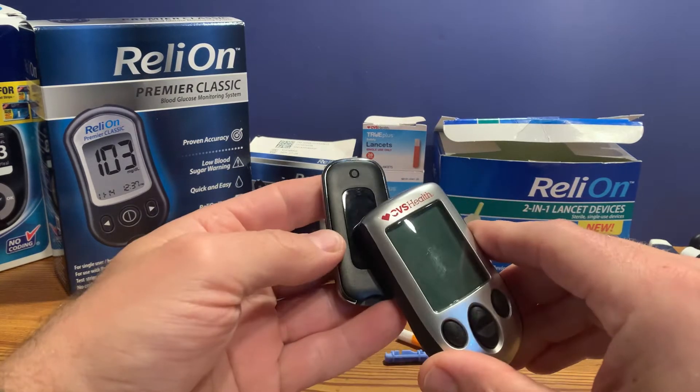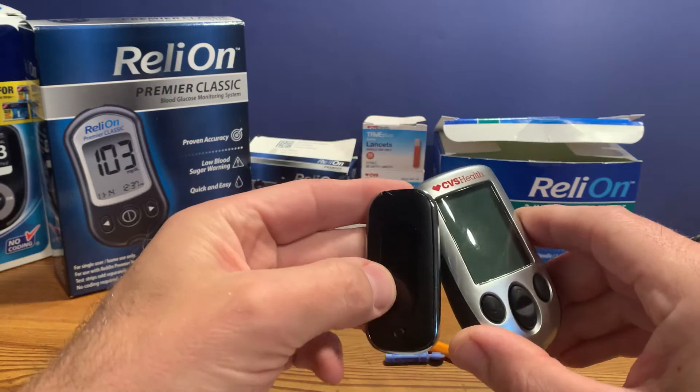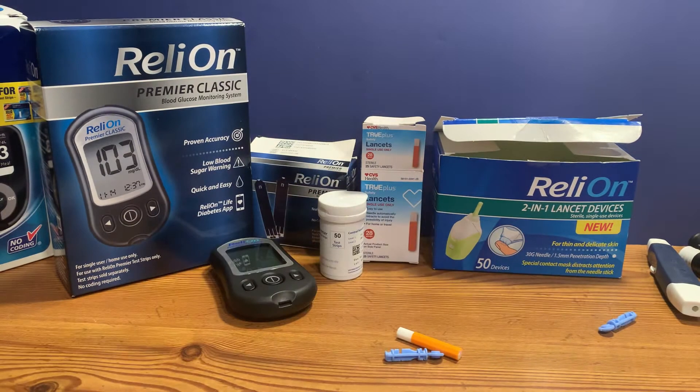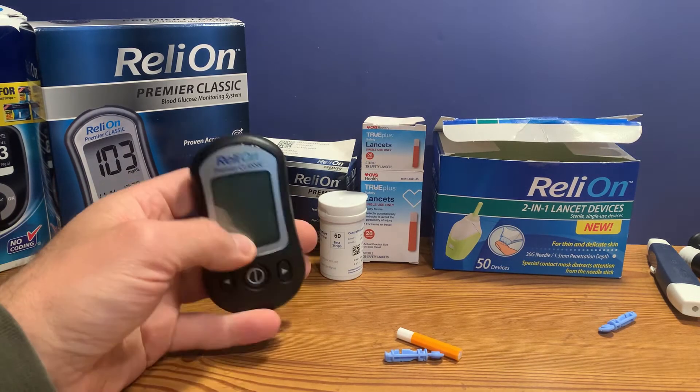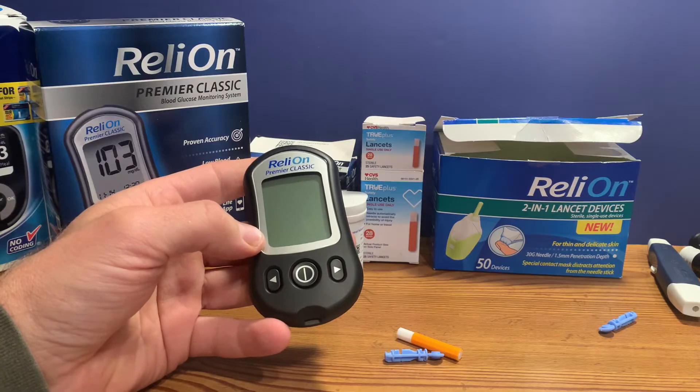CVS also has their own meter — the CVS Health meters and test strips are affordable and easy to find if you live near a CVS pharmacy. For this demonstration, I'm going to show you the Relyon Premier Classic, which is sold by Walmart.